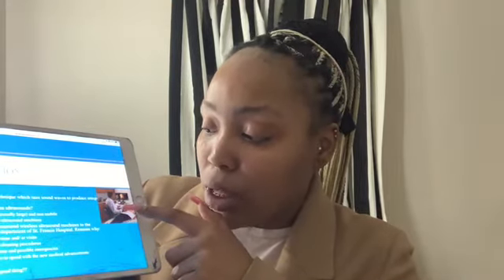Some important parts of the ultrasound machine are the monitor, where we see the pictures, the keyboard, the processor, the data unit storage, and then the main important part here, the probe. That's the part where we put on the jelly when we're trying to see things.